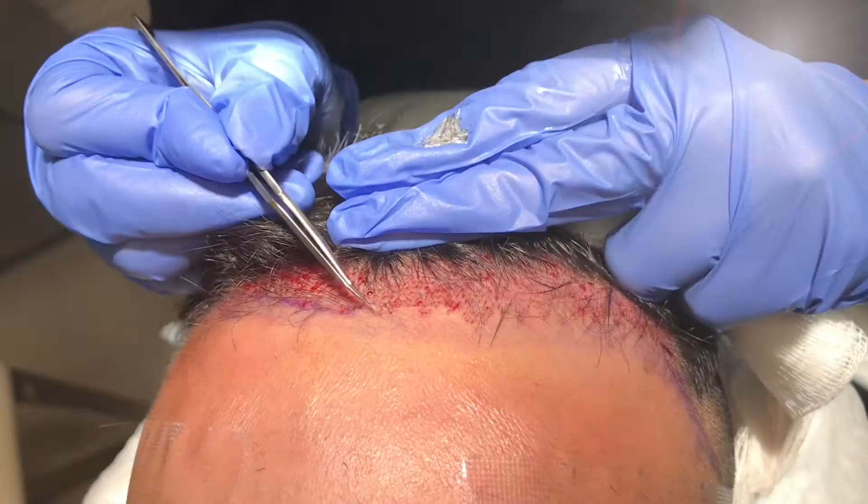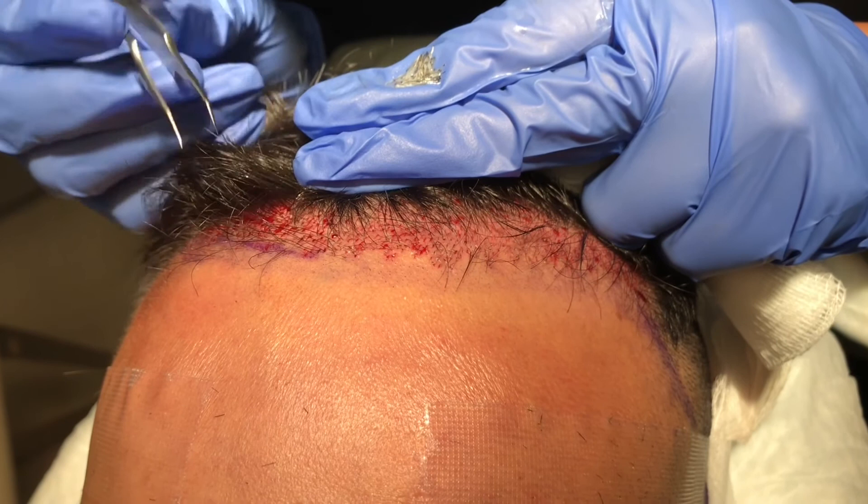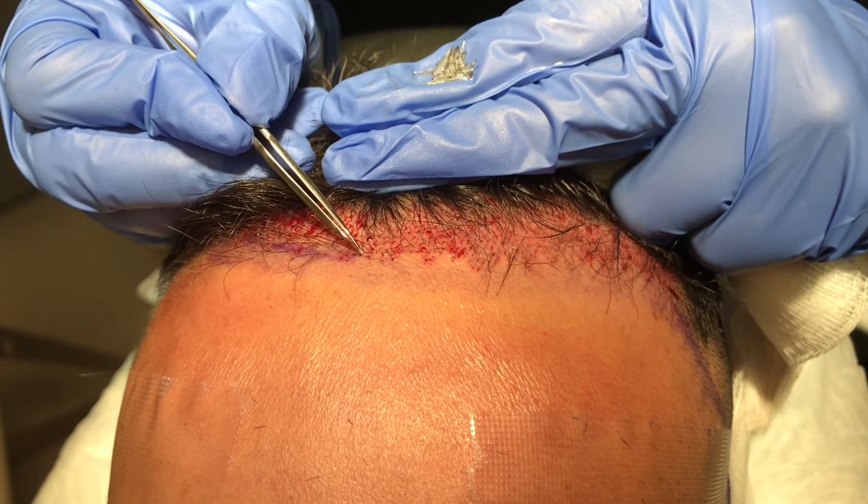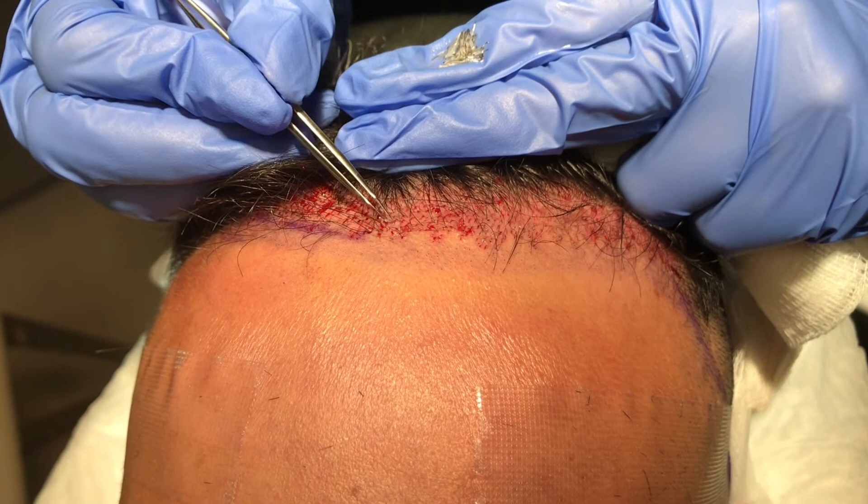At this stage we're putting the individual hairs directly into the little holes that we made. They're also put in at the right angle — the ones at the very forehead at the widow's peak are placed facing forward because that's how the hair normally grows. Each individual hair is painstakingly placed so that we get to manually control exactly how the hairline turns out.